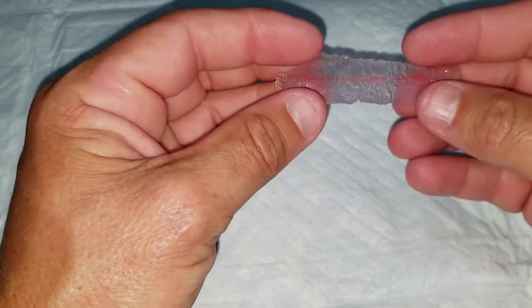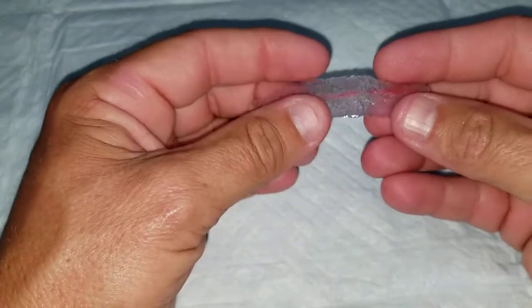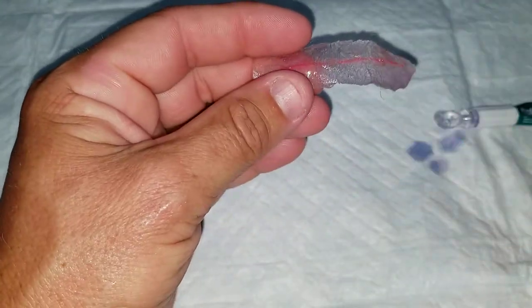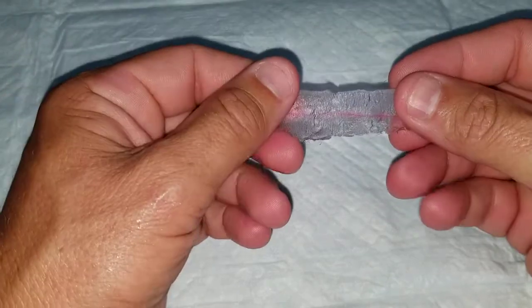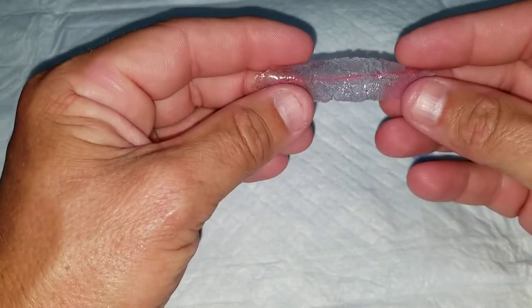So that's why I said one even coat like before is harder to remove, whereas if they keep applying glue on top of glue on top of glue, then this is the effect, and you can actually remove it from the skin.